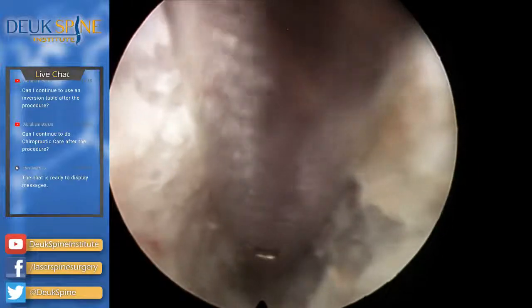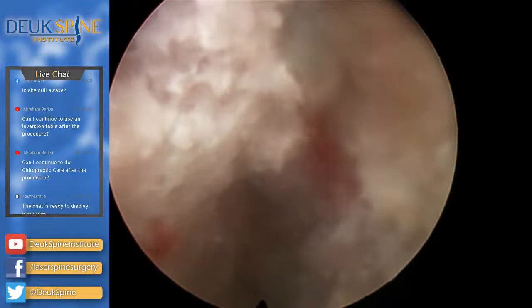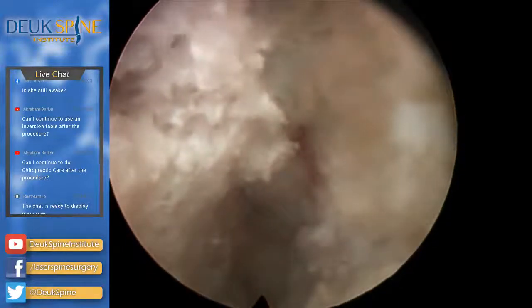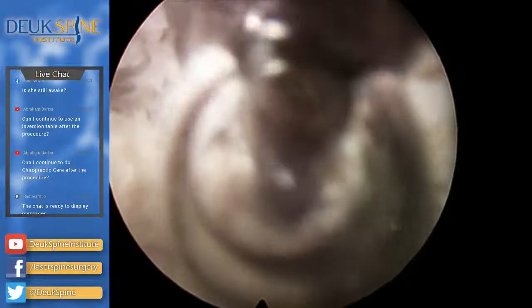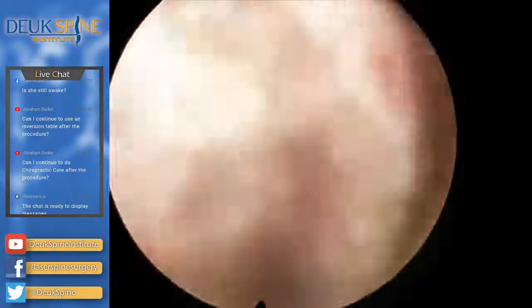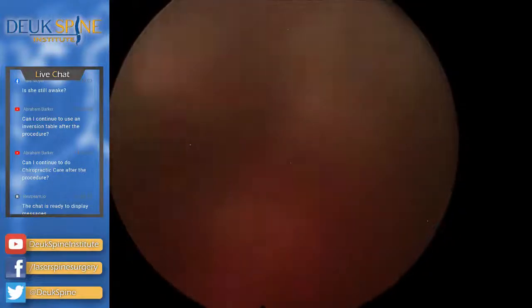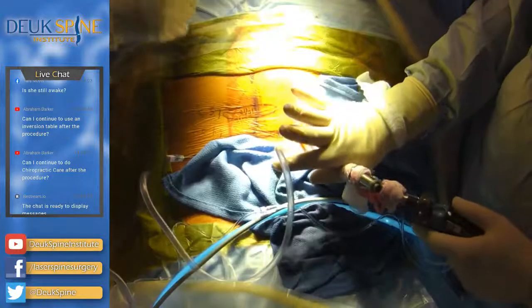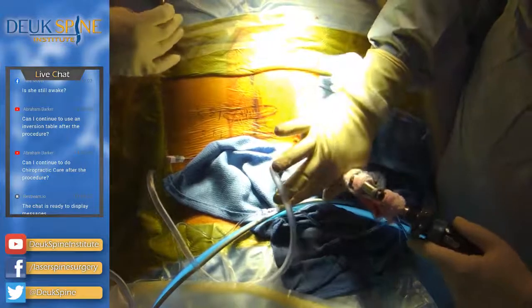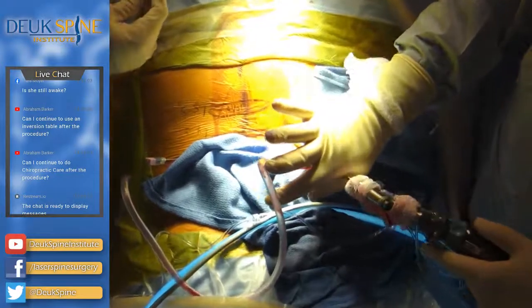Lights on, please. Thank you. Okay, very good. I'm happy with that. Scope up. Scope off.